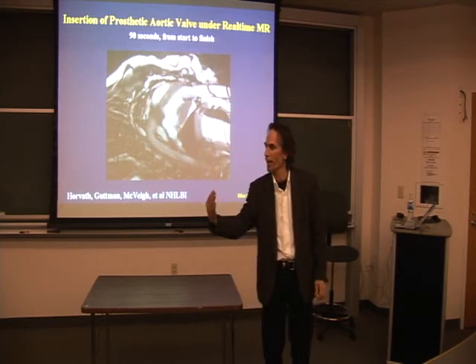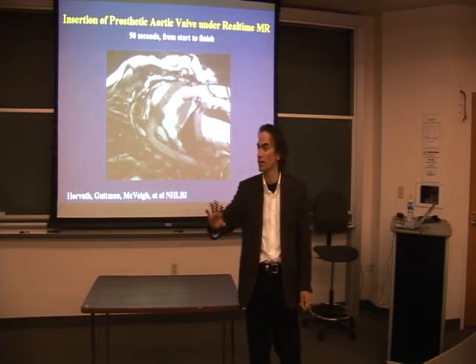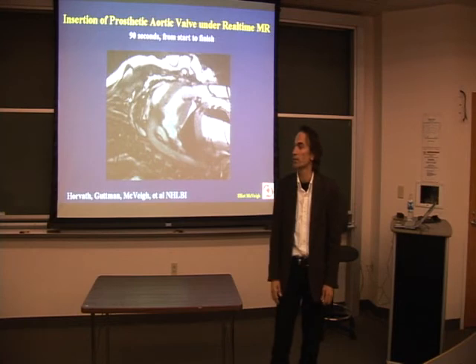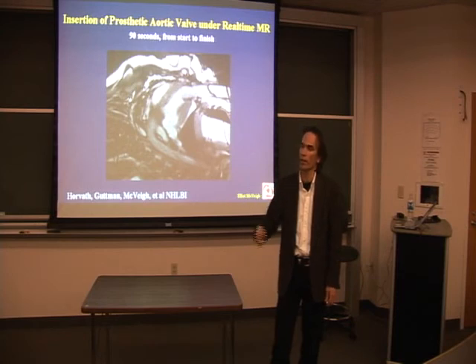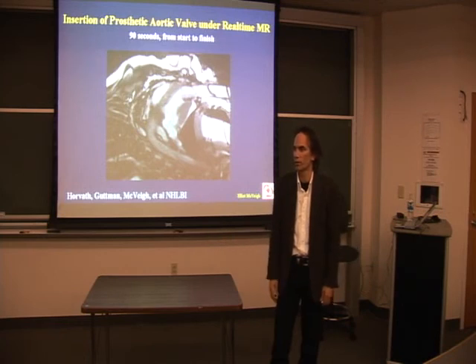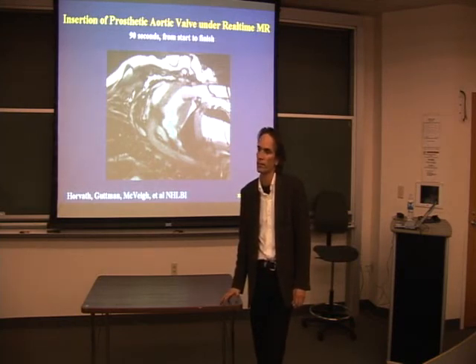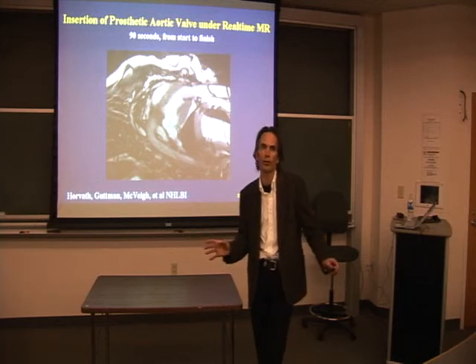If you want a 200 millisecond delay of the images coming out and going across the screen, then it's about 30 frames a second, probably. But if I have something that repeats over and over again, you can analyze offline and get down to the millisecond. So you just take an echo every 2 milliseconds. Then you can shift the whole thing.